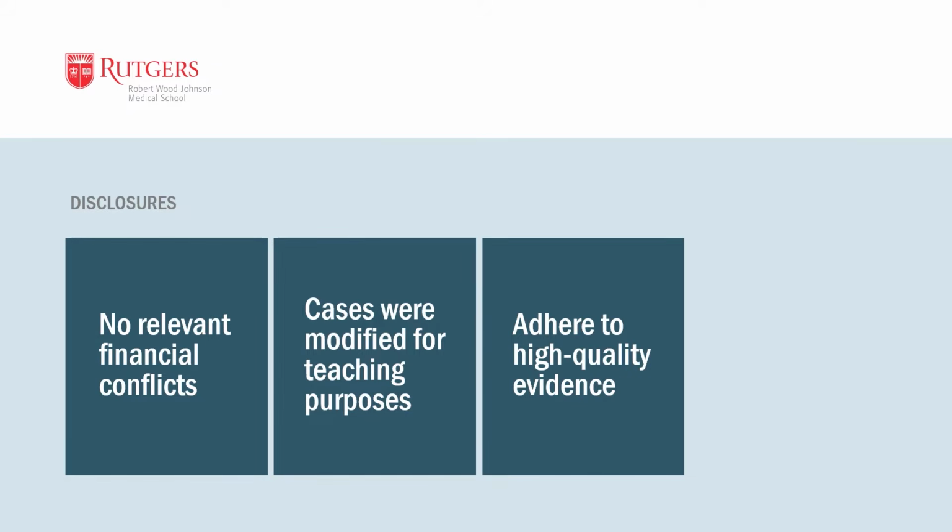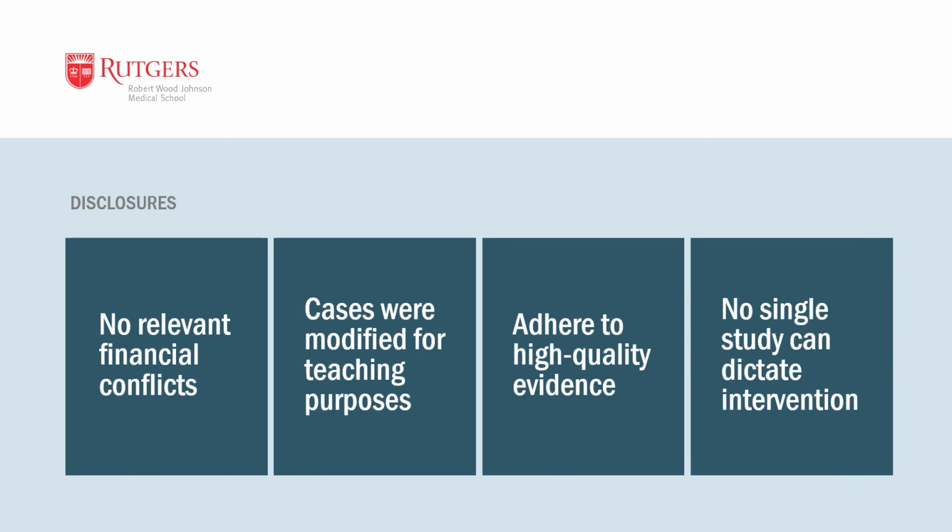CT perfusion is an exciting and rapidly evolving imaging modality, but for the purpose of this talk, we'll try to adhere closely to high-quality evidence. Debates about the finer points of perfusion are outside the scope of this video. Lastly, no single imaging modality can qualify a patient for stroke intervention. Let me say that again. No single imaging modality can qualify a patient for stroke intervention. You must always look at the entire clinical picture.